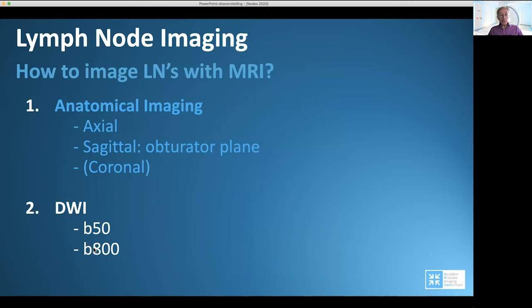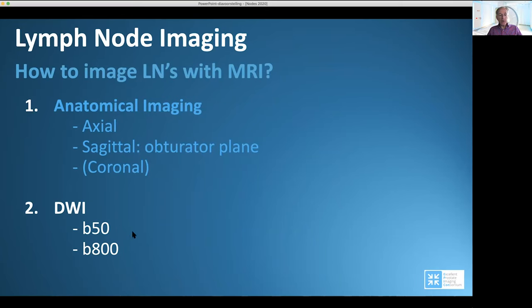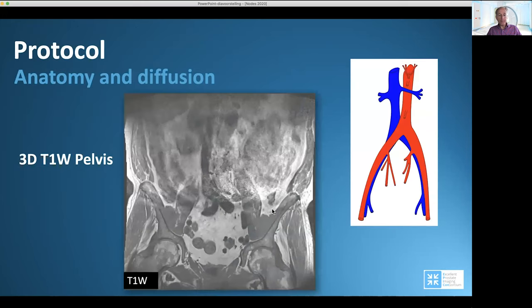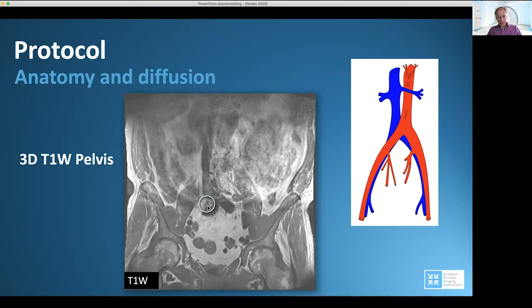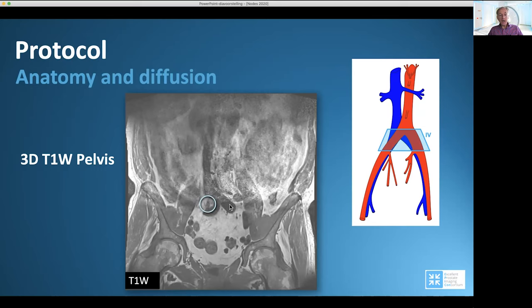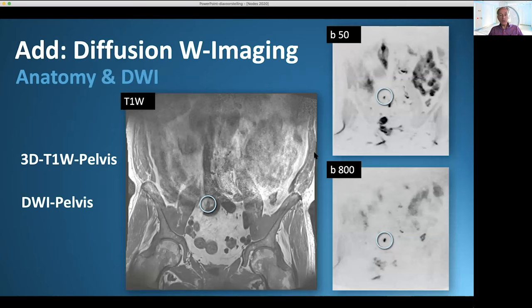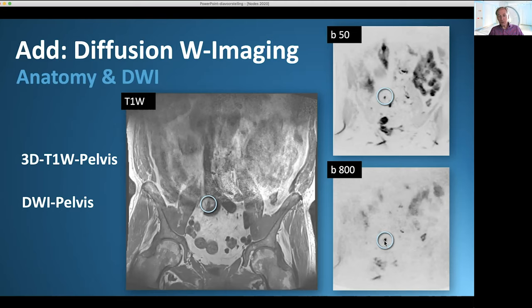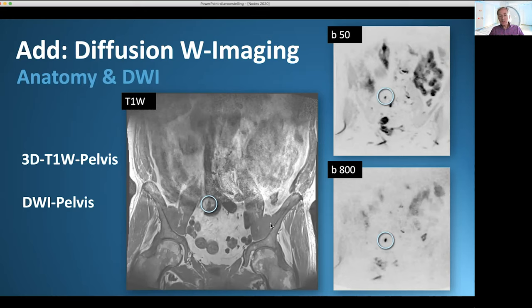Besides anatomical images, diffusion-weighted images are important. We use a low B value and a high B value. There is a lymph node which is rather large — just beside the aortic bifurcation, so in the common iliac region. On the diffusion-weighted image it increases in signal on the high B value, meaning there is restriction. When there is fluid, the signal decreases. So when the node increases in signal, you should be very careful — it can be pathologic.